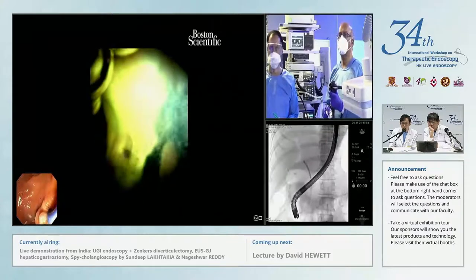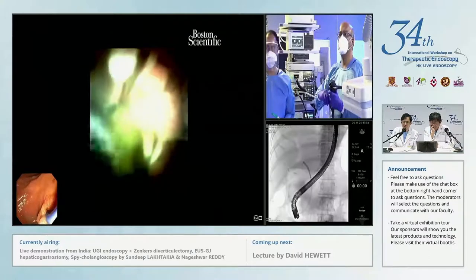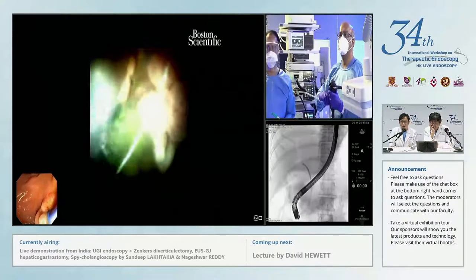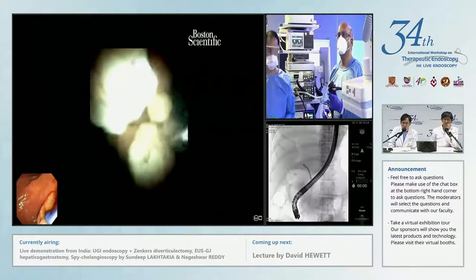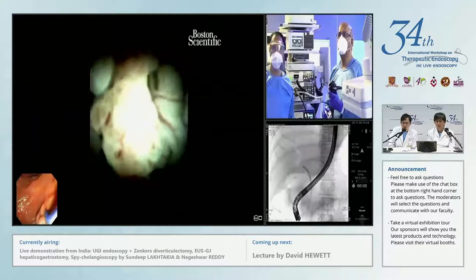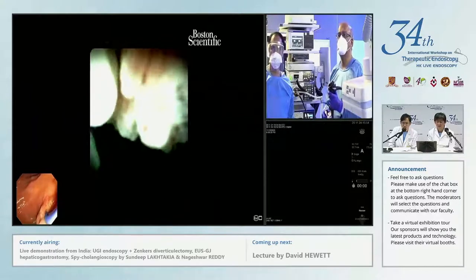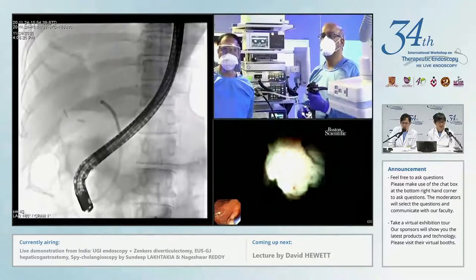And now we are starting to see some villi type of appearance there. Can you see that? Oh, yeah. Okay. Well, here it is. Very tight. Wow. Very tight. So these are nice villi that you see here. Yeah. So this is starting right at the hilar region. If you can see the fluoroscopy, you can see that the hilar region is starting. And we are starting to see this very nicely there.